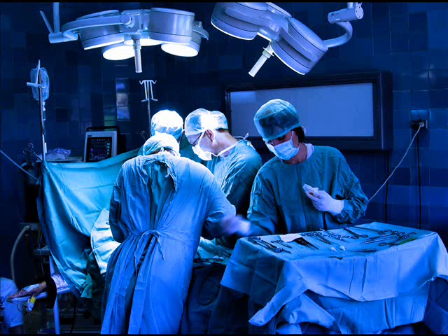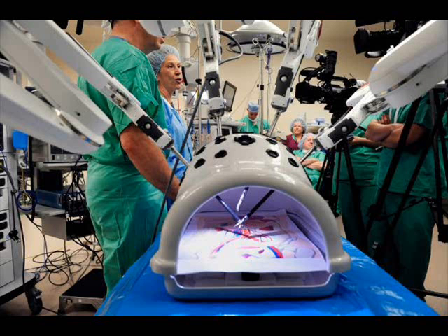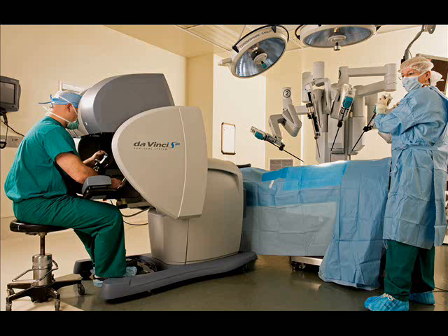Study parameters have looked at intraoperative patient preparation time, length of time to perform the operation, adequacy of the removed surgical specimen with respect to clear surgical margins and number of lymph nodes removed, blood loss, operative or postoperative complications and long-term results. More difficult to evaluate are issues related to the view of the operative field, the types of procedures that should be performed using robotic assistance and the potential added cost for a robotic operation. Many surgeons feel that the optics of the three-dimensional, two-camera stereo-optic robotic system are superior to the optical system used in laparoscopic procedures.